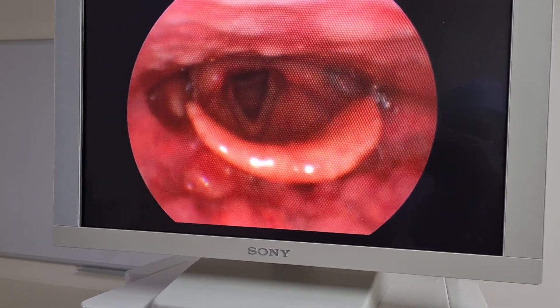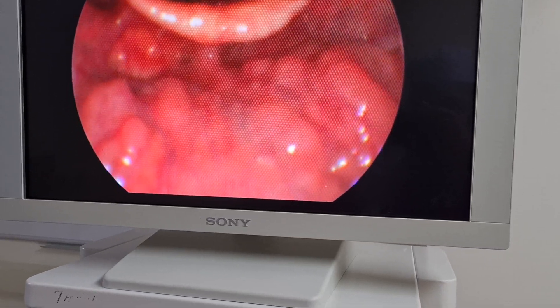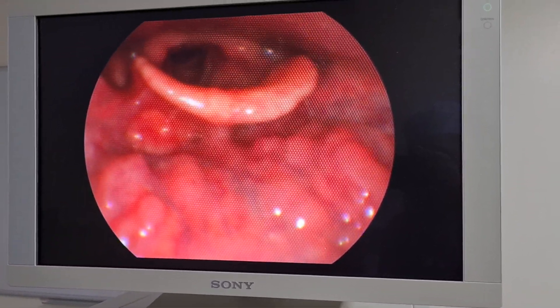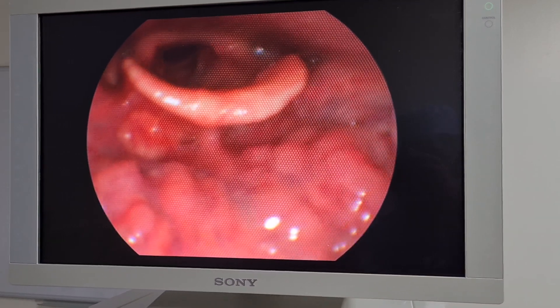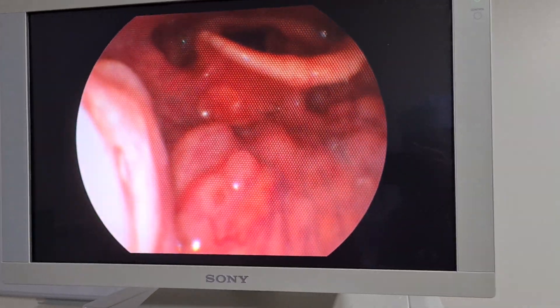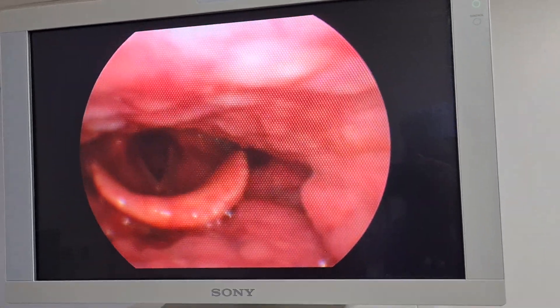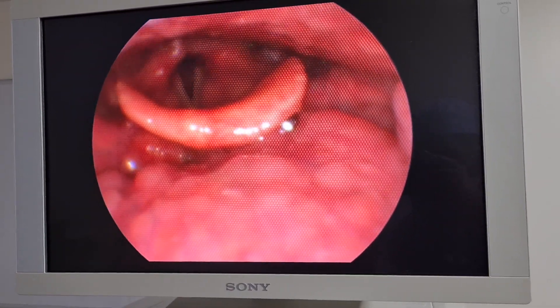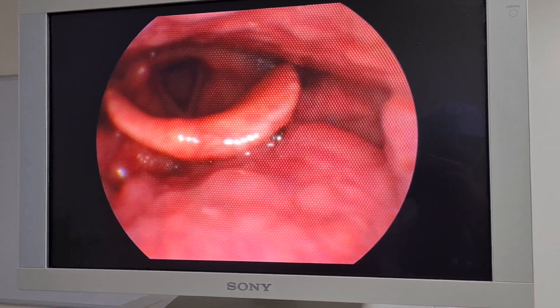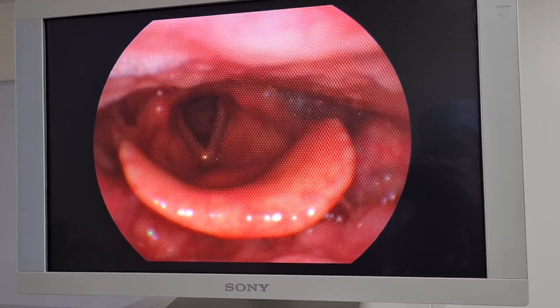Can you stick your tongue out? We're going to try to get a better view of the tongue base and see whether we can see anything here. As you can see on the left side, that looks like a retention cyst. These are the tonsils — that's the left tonsil, and this is the right tonsil just under here. Nice deep breath in again. You can always refocus and adjust how far you go down — not going to touch any tissue there, because it will stimulate the cough reflex and we don't want to do that.